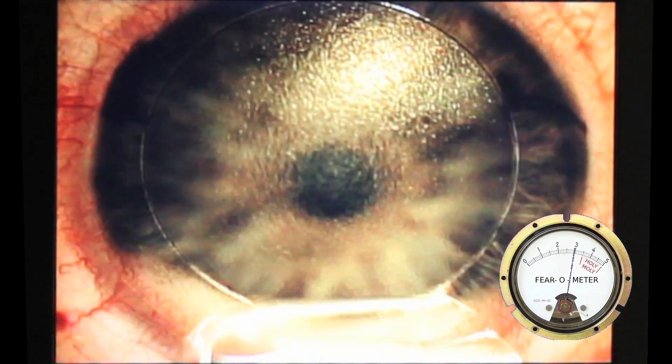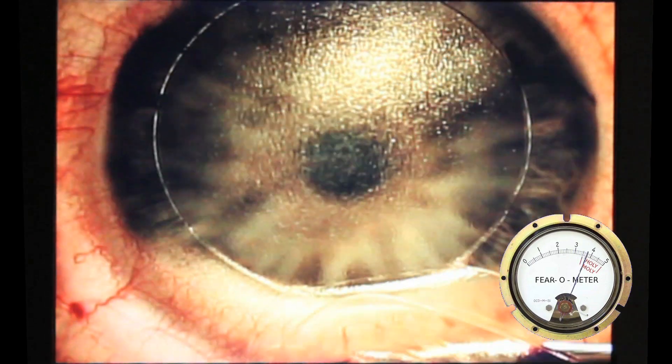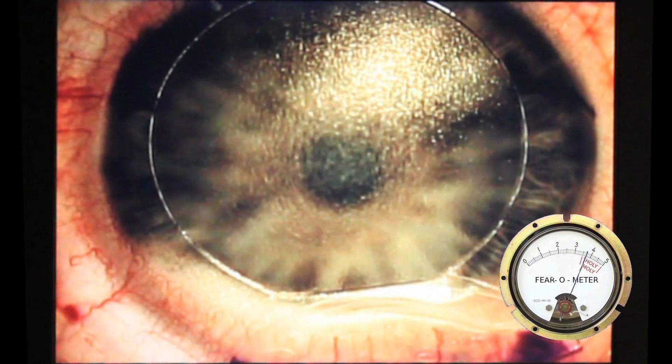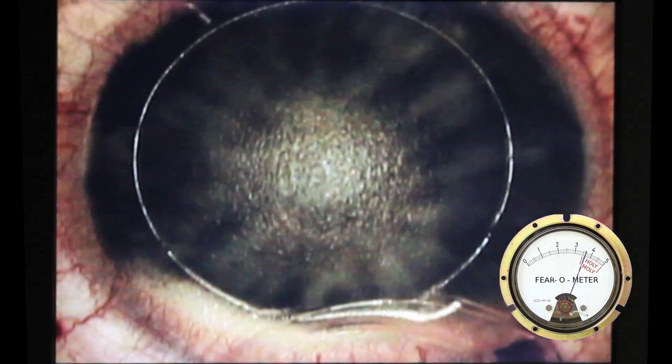When he pulls the flap back, it's like you're in some kind of spaceship. Because you're still trying to look at that little target that he told you to look at and stare at. So you're still looking as hard as you can. But everything is blurry. And I mean totally blurry. And then the lights go out. And he says, don't move. And he counts to 20. And while he's counting, the laser starts firing.